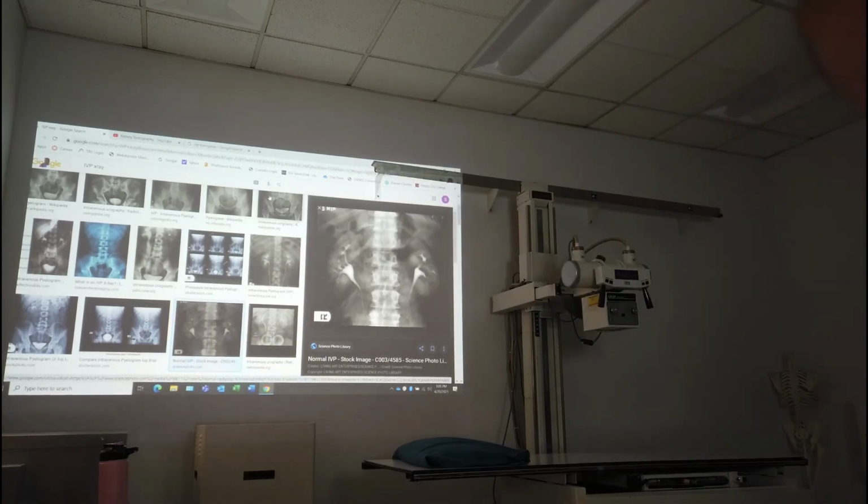And usually the kidneys are like 8 centimeters, 9 centimeters above the table for a normal average sized patient. What they do is they measure the patient, and there's a calculation they do to figure out which cut to do. But we as techs will do a scout film, like an 8 or 9 centimeter scout film, and we'll show the radiologist. And the radiologist is like, okay, yeah, that's pretty good. Do an 8, 9, and 10 centimeter cut to the patient. So we'll either do 8, 9, 10 through those kidneys. But it does require the measurement of the patient.